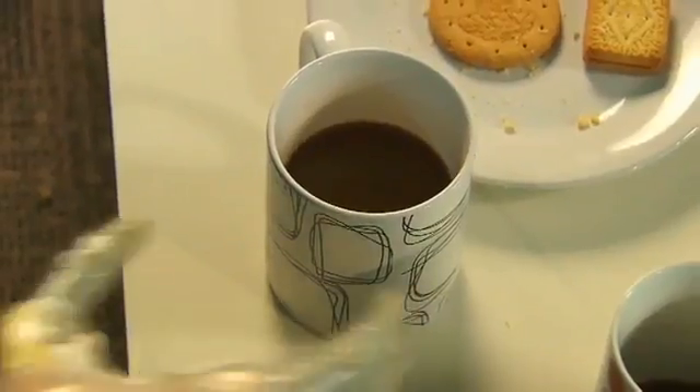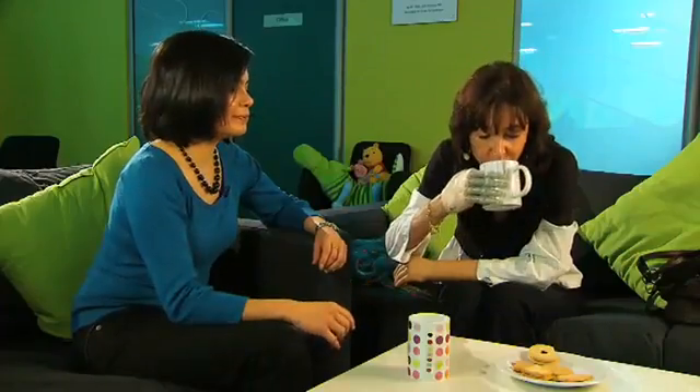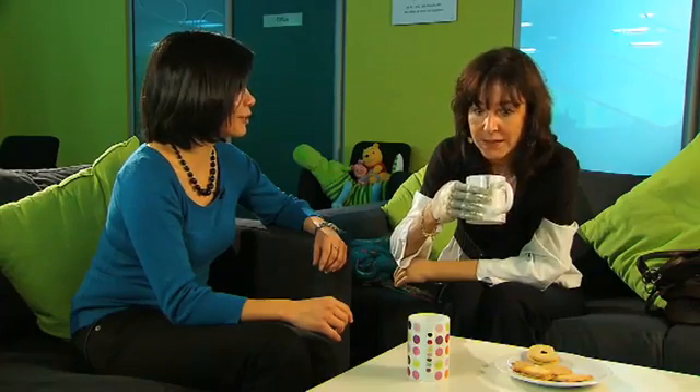My first impressions of the hand were very positive. I was very happy to be able to do things that I was not able to do before — even the simplest things like holding a glass and bringing it to my mouth and drinking. That was something that I could do with the hand for the first time.